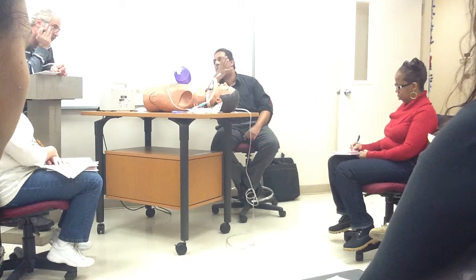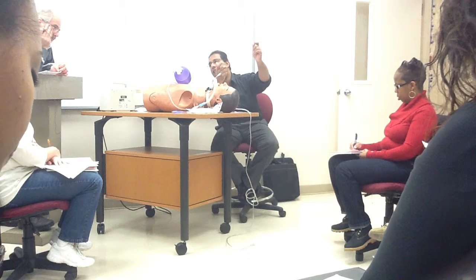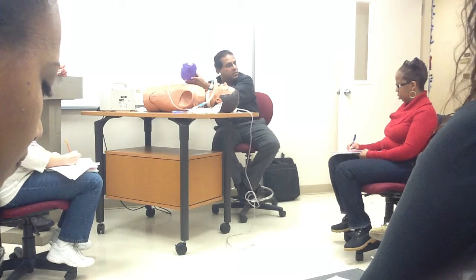The question is not only do you hyperoxygenate them, do you want to hyperventilate them? Yeah, you do want to hyperoxygenate and hyperventilate the patient. Well, you cannot hyperventilate somebody with a trach collar. What you can do is ask them to take deep breaths while you turn the dial up to 98%. And if they can do that, you don't need a bag. You turn the dial up to 98% on the bottle.